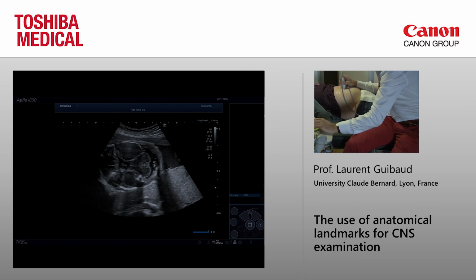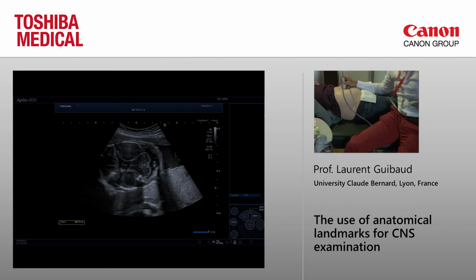This one. Okay, 29. So with that, if you have a corpus callosum agenesis and you want to be sure it's isolated, you have to be sure that the maturation of the brain is in fact consistent with the gestational age, and this is the case here.